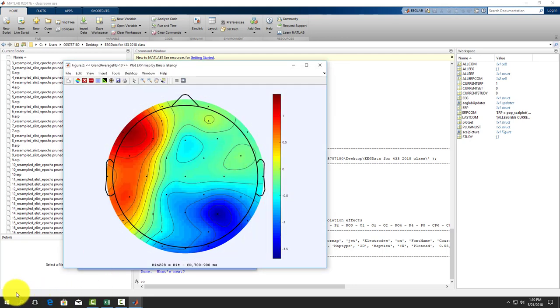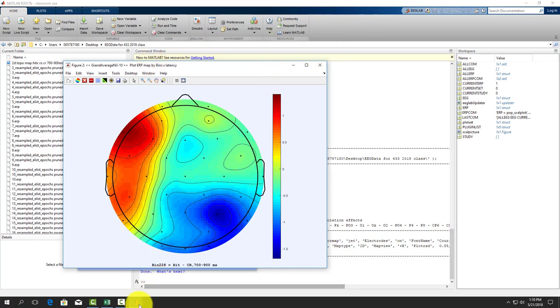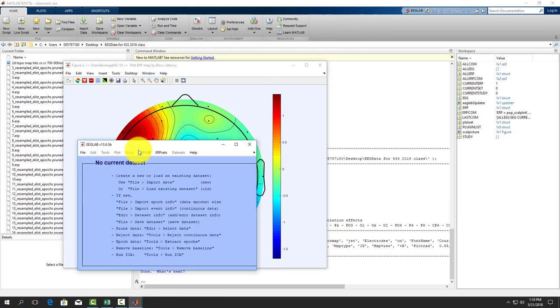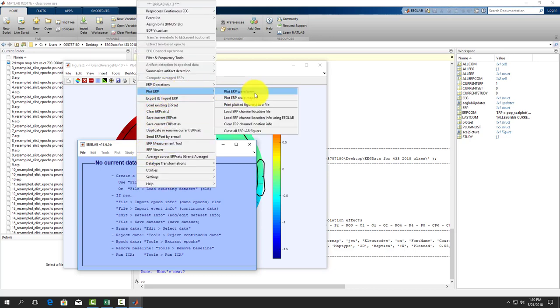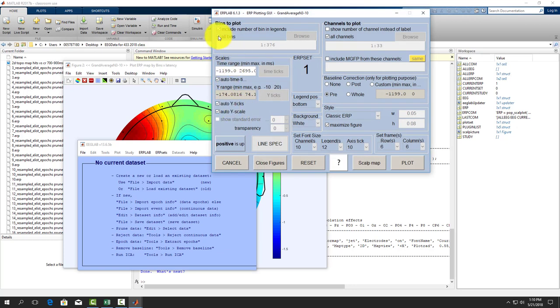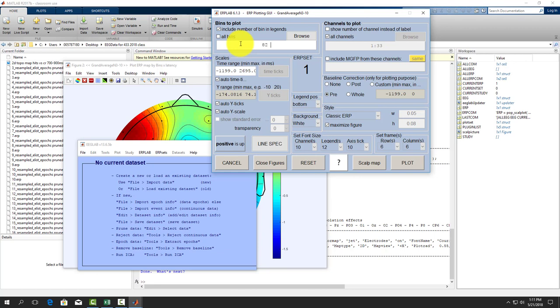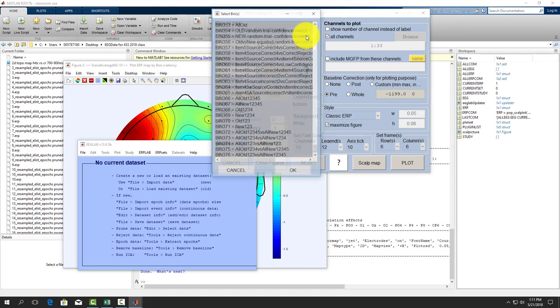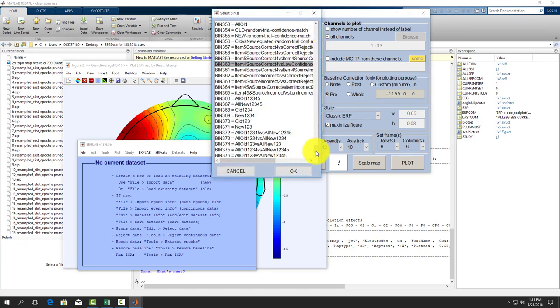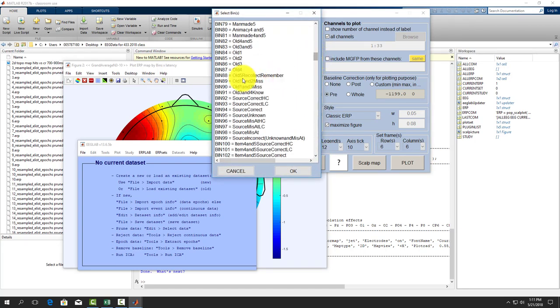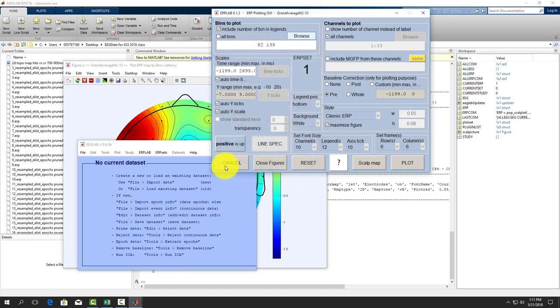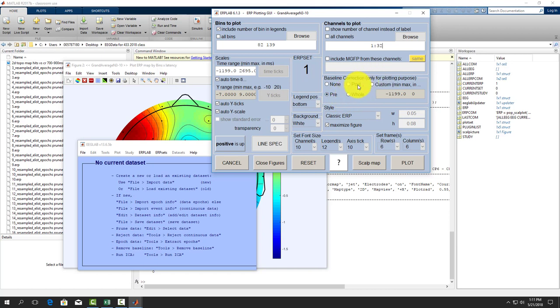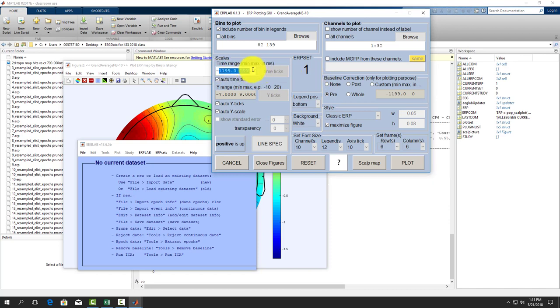The next thing we can do is create our ERP figure. So now we go to ERP lab again, plot our ERPs using ERP waveforms. We're going to uncheck all bins. I'm moving quick because you guys have all done this before. It's conditions 82 and 139, our old fours and fives and new item correct rejections. We want to baseline correct to the pre-stimulus period and plot negative 200 to 1500 milliseconds.